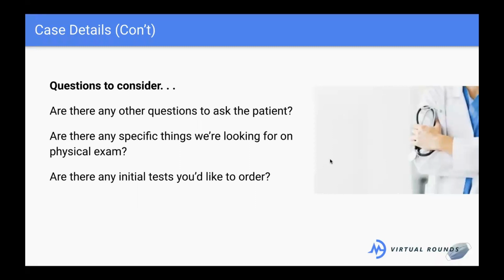And Joshua says an echo. I like the idea of maybe getting an echo. Maybe it's not the first thing we do, but certainly if we hear a murmur, then we'd like to see how the heart is beating. You guys are doing great, amazing.